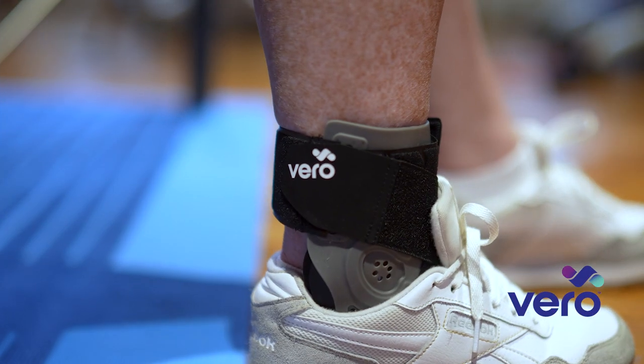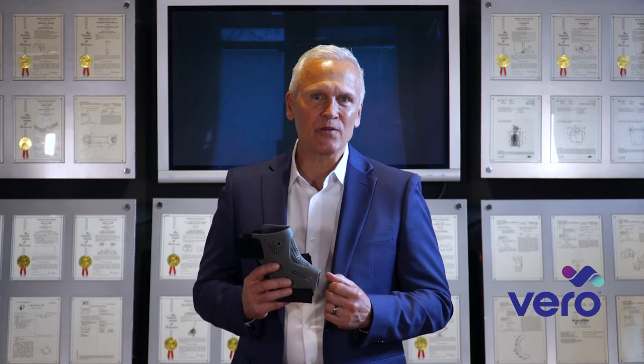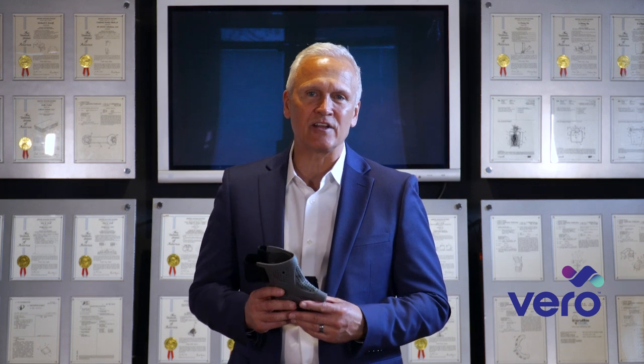Hello, I'm Dr. Brian Den Hartog, and it's my great pleasure to introduce the Vero Ankle Brace. I'm a board-certified orthopedic surgeon specializing in ankle surgery, care, and rehabilitation.